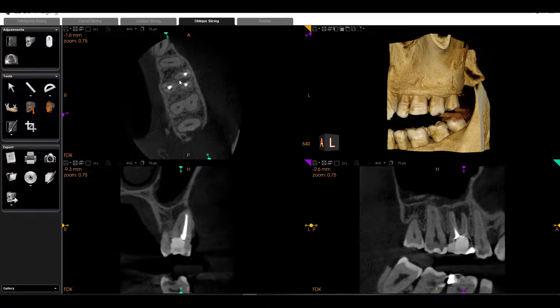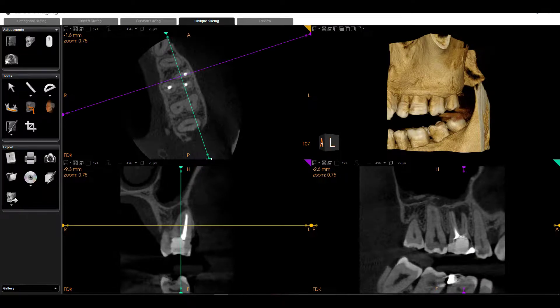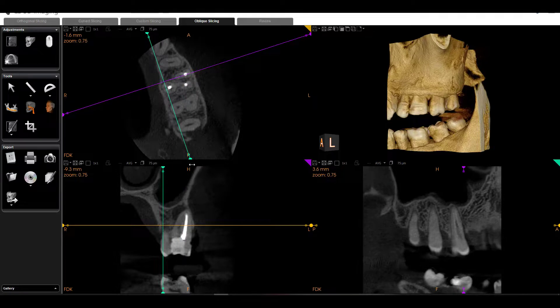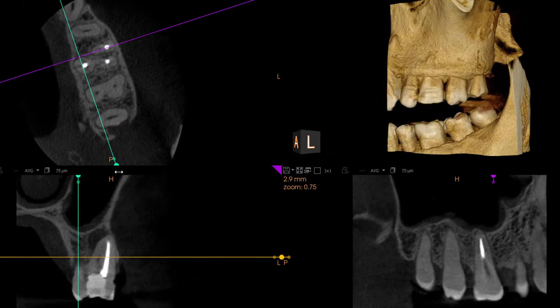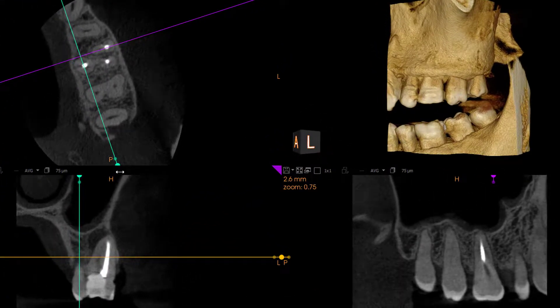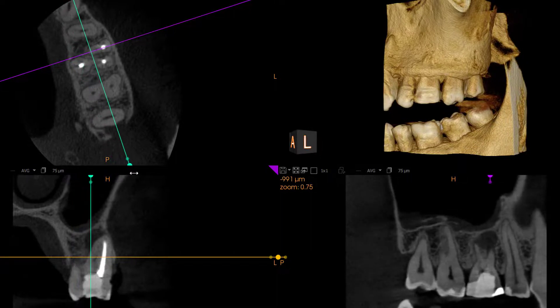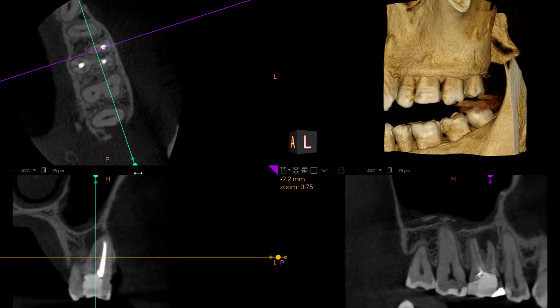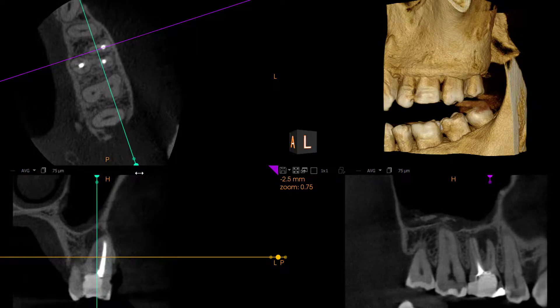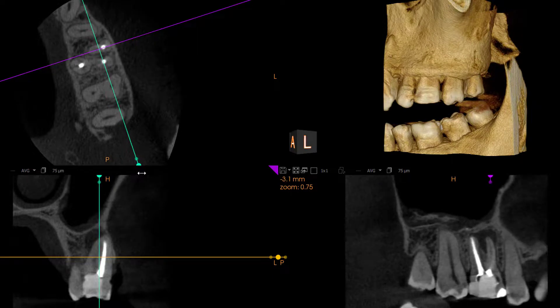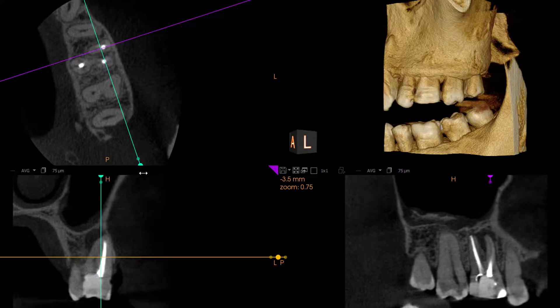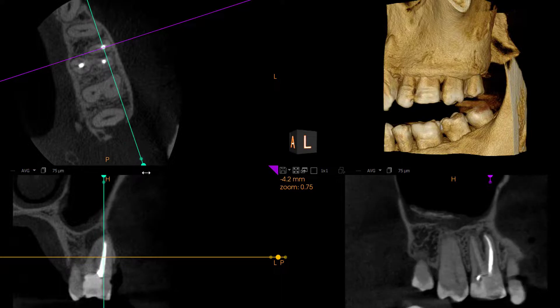Now let's look at the entire tooth for a second. Let's grab our oblique sagittal view — you can see in the lower right here's our palatal root. Now we're on top of our MB2. Here's our distal buccal root, and here's our mesial buccal root.